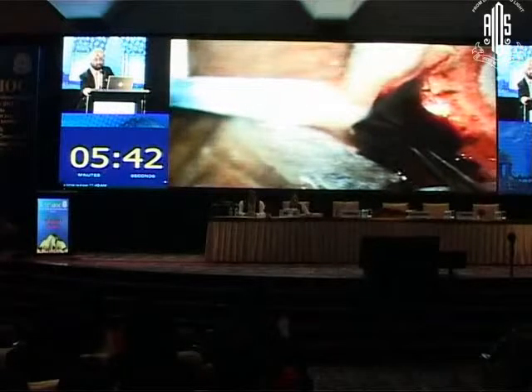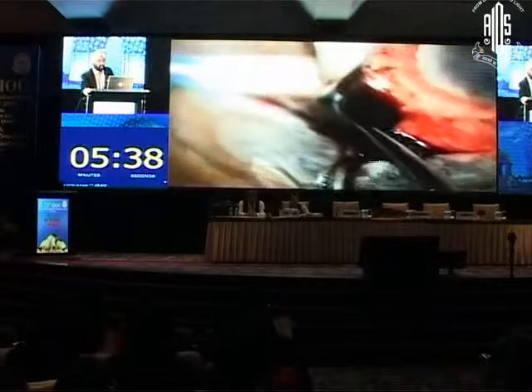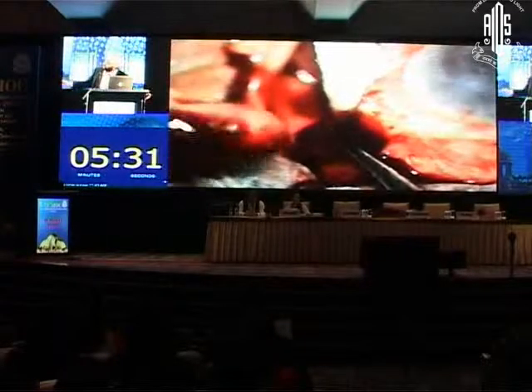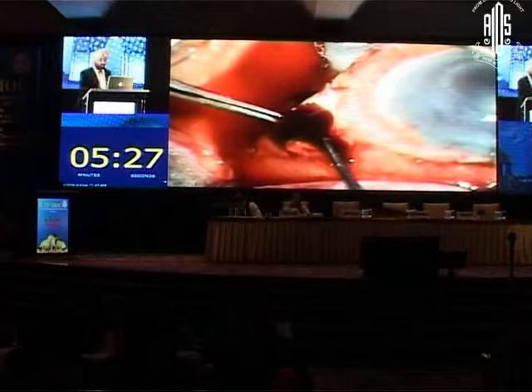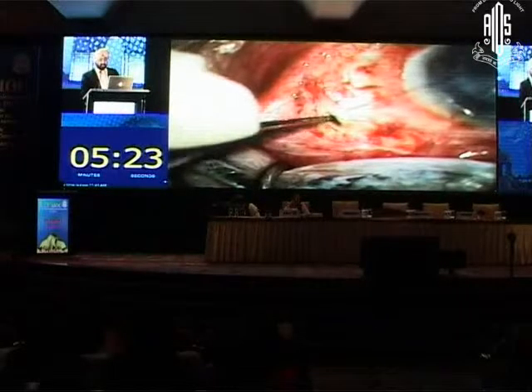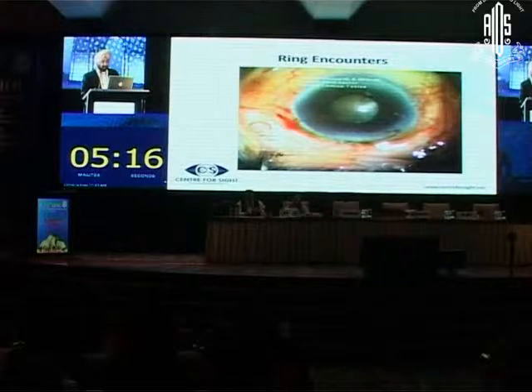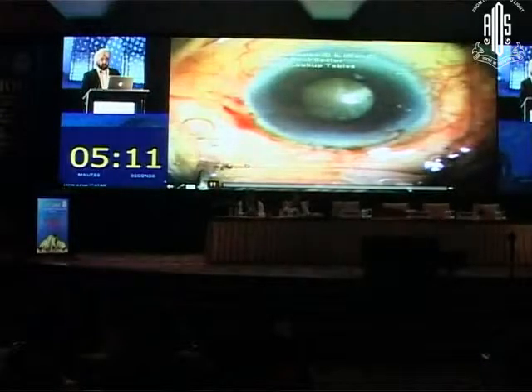It was an undetected suprachoroidal hemorrhage. It didn't go into a frank expulsive hemorrhage, but we did not recognize it on the table. Had it been recognized on the table, one would have been able to get a better outcome in this particular case. So you can see that the suprachoroidals have been drained, and after that a suture, and this is the next and last situation that we are talking about.